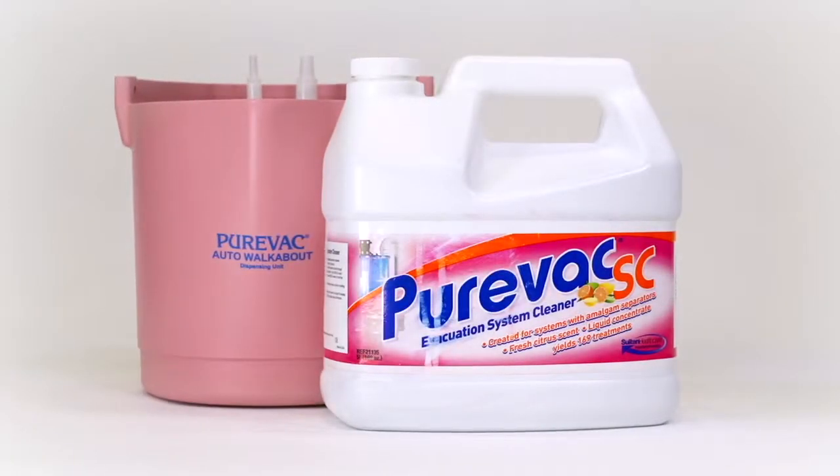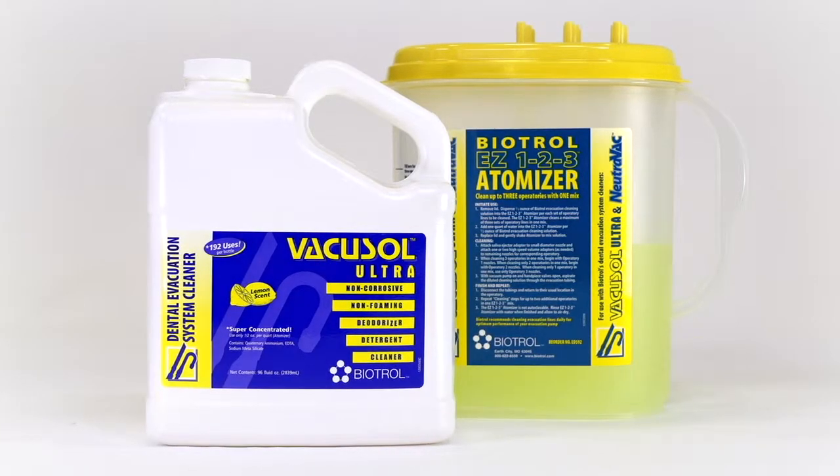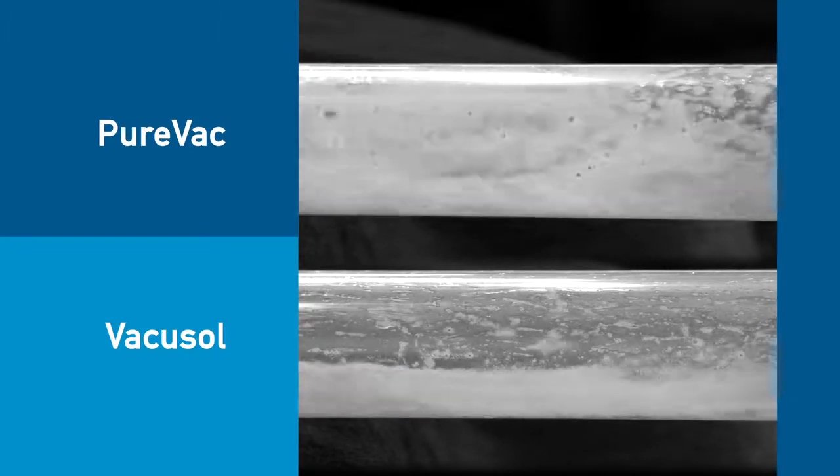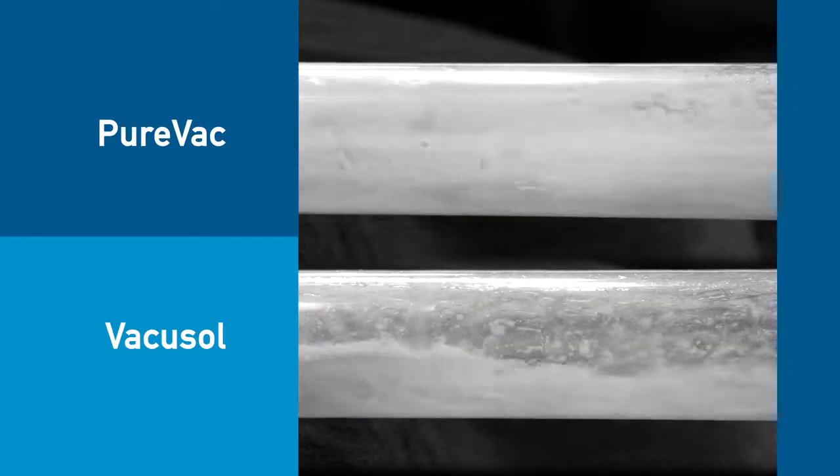PureVac's Walkabout and BioTroll EZ-123 Atomizer were found to create an uneven flow in the evacuation lines, putting stress on the vacuum pump.